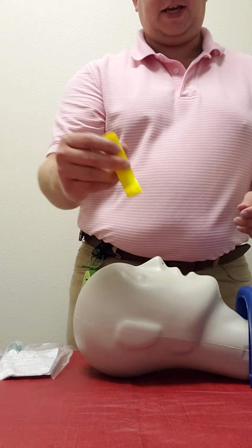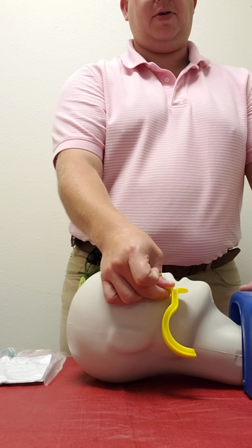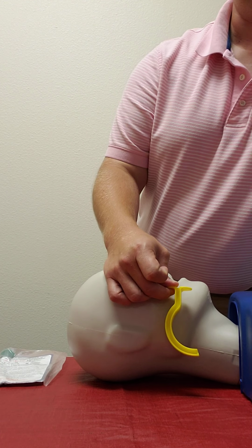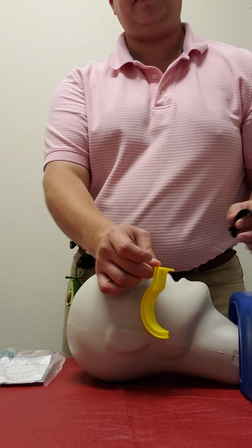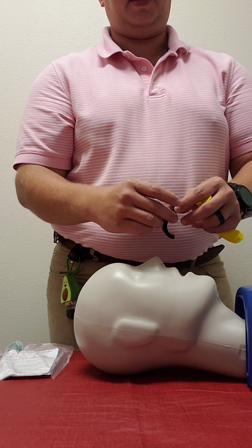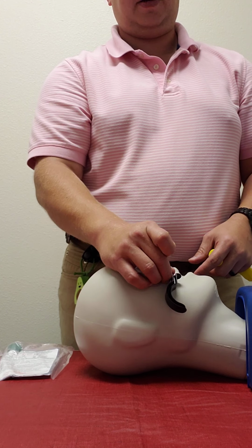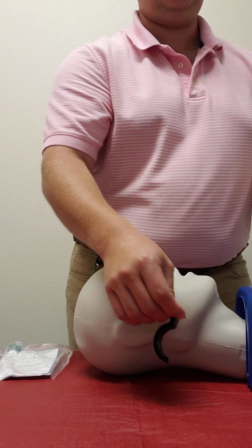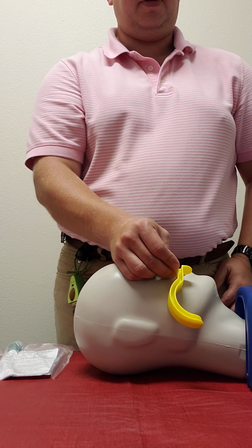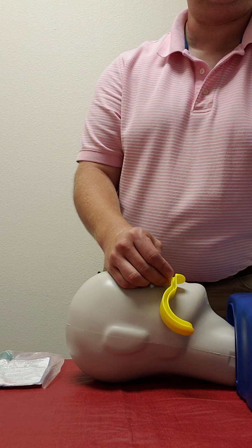Well, you simply take this, you hold it next to their cheek, and you see where it lines up. We want this to go to the base of the tongue to try to keep the tongue from occluding the airway. So obviously, this is not going to go to the base of his tongue. This is more likely to go to the base of his tongue. That's what you're looking for when you measure.